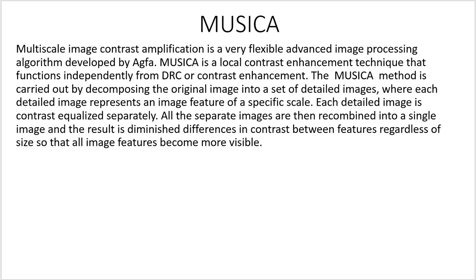Musica has nothing to do with the music industry. Multiscale image contrast amplification is a very flexible advanced image processing algorithm developed by AGFA. Musica is a local contrast enhancement technique that functions independently from DRC or contrast enhancement.